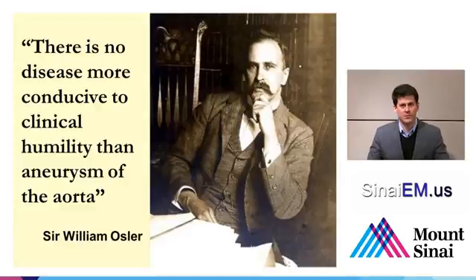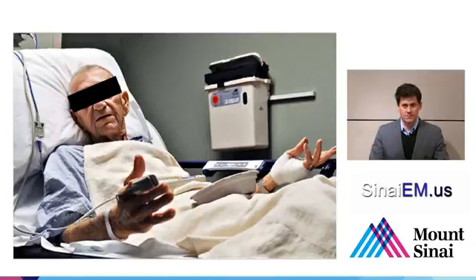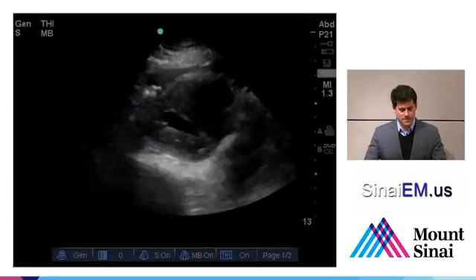So why do we care about this? Well, we care about this for patients like this gentleman who was admitted to an emergency department for syncope, and he had a relatively normal EKG, a normal laboratory evaluation, and a fairly normal physical examination. Maybe some mild abdominal tenderness, but nothing terribly focal. He was admitted for observation in the standard sort of syncope evaluation, and a bedside ultrasound was performed because he had some mild abdominal tenderness, and this was found.